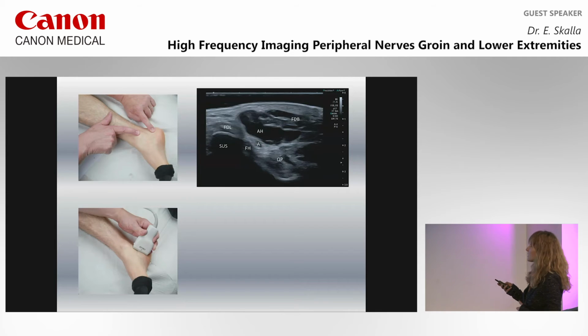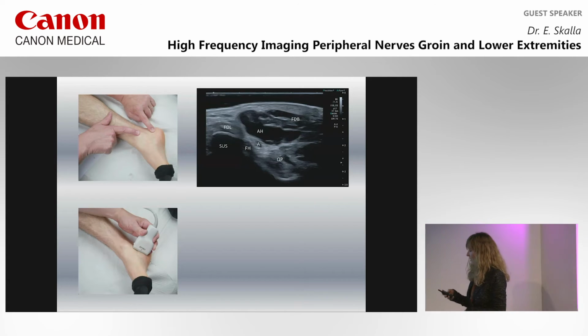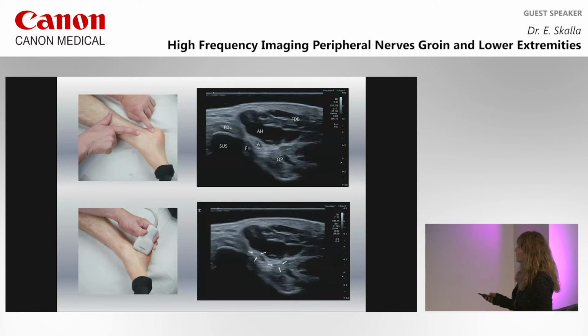structure. So this is the talus, the sustentaculum tali, the long flexor tendons, the short ones, the abductor hallucis tendon. And in the deep, this is the quadratus plantae muscle. And the most important internal landmark to my mind is the plantar artery, which we see in the center of this connective tissue space here. And it's surrounded by two nerves, so it's in the middle of two nerves, two cross-section areas. These are the medial and the lateral plantar nerve.